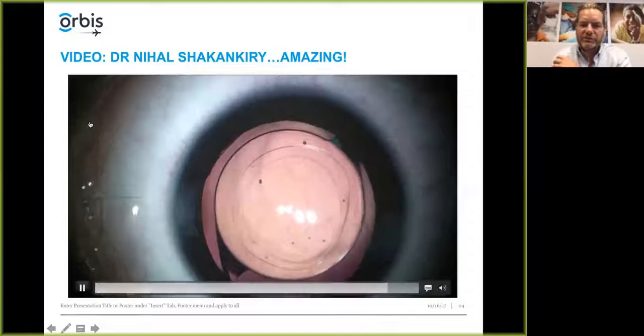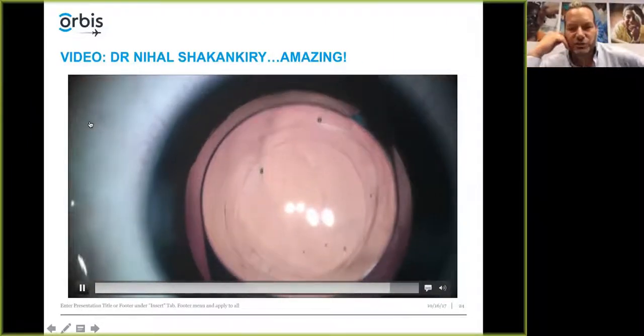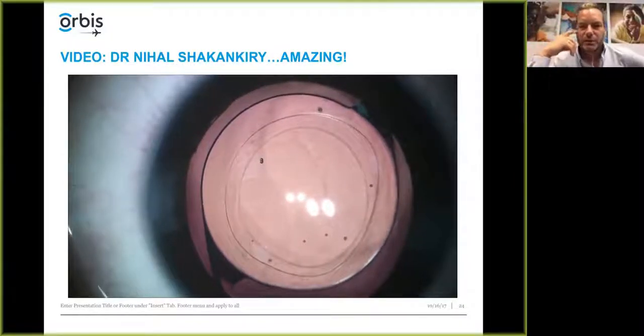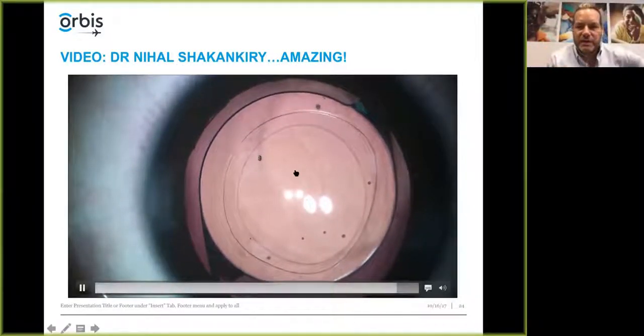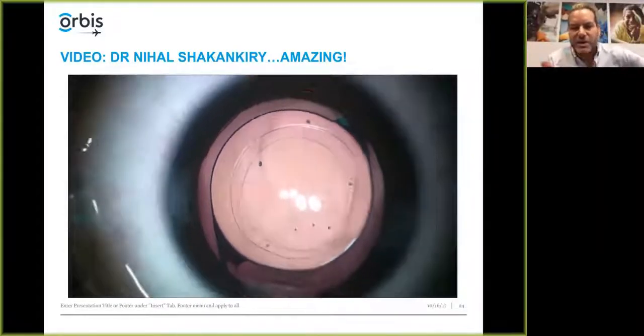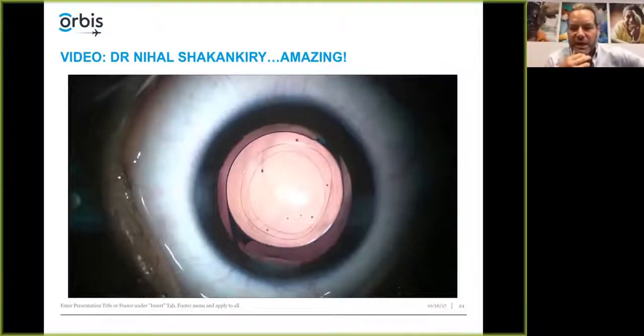And while this is playing, I just have looked at our questions. There's a question about the extent of anterior vitrectomy in pediatric cases. Well, the extent of how much vitrectomy you might do is relatively limited. I mean, I think you can't really see the vitreous. I don't stain it in most cases.